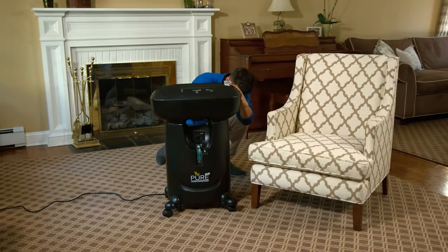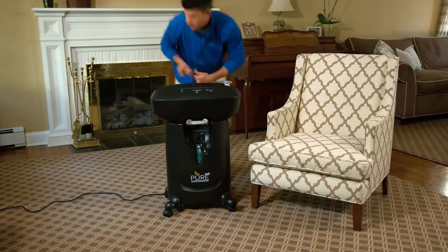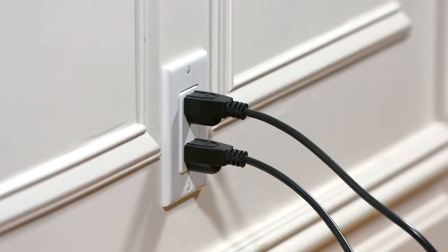The unit should be at least 24 inches away from objects which may obstruct the ventilation. Additionally, the unit should be within reach of an outlet, without using an extension cord.